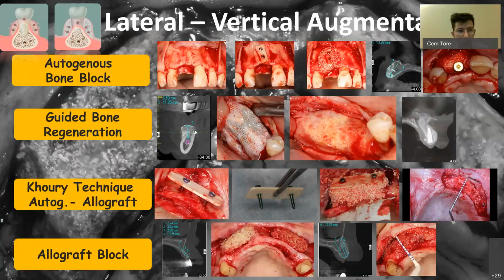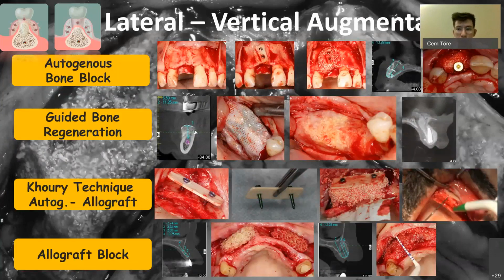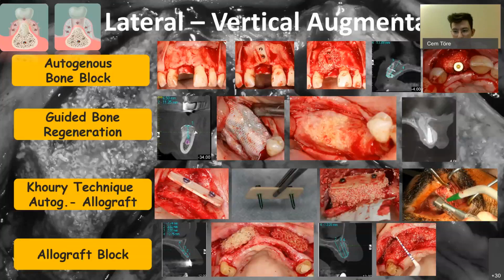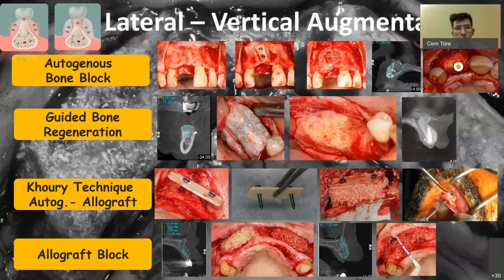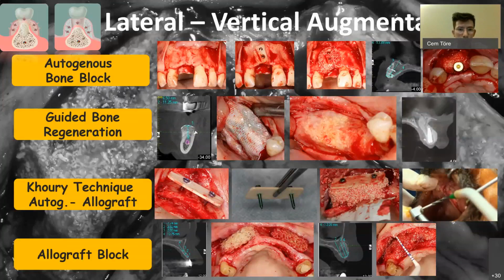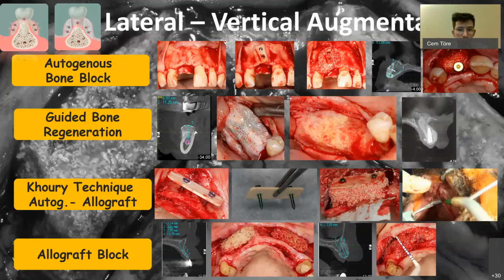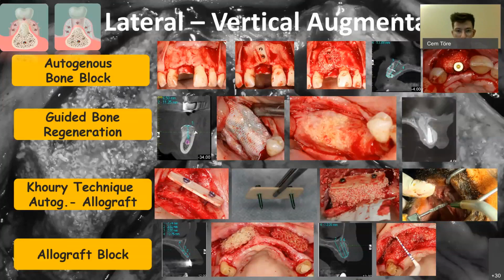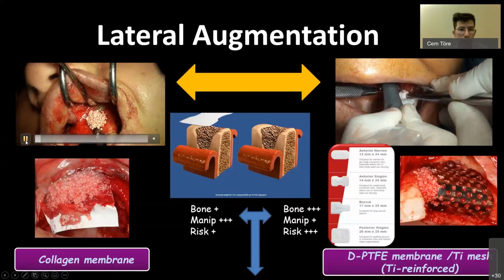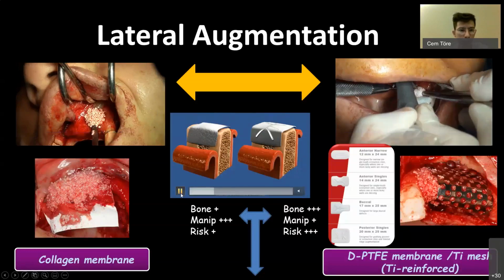We will mainly be focusing on guided bone regeneration, not because I'm lazy, but because we have tried, as you can see, all of these, and the best results by far we have had was from guided bone regeneration, which means it is foreseeable, it's predictable, which is a very positive quality you want in a treatment choice. So let's start with these in the beginning.